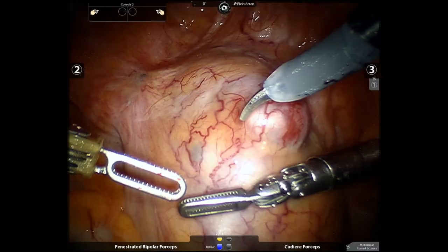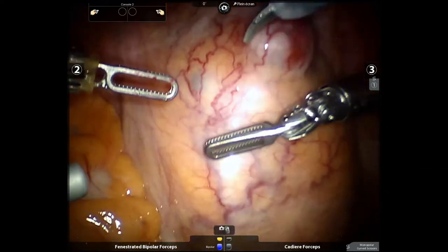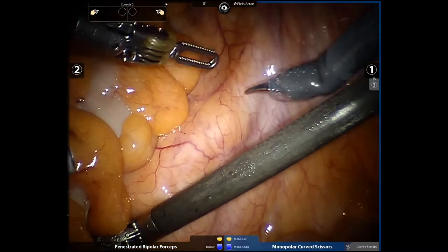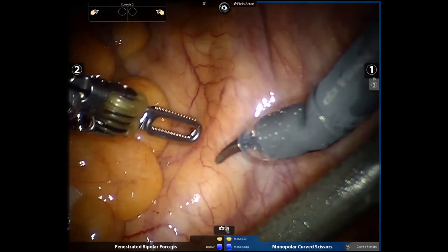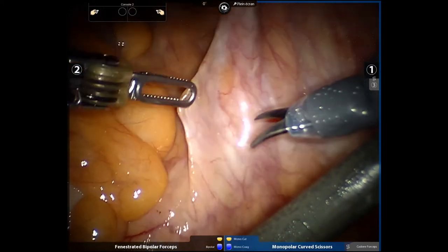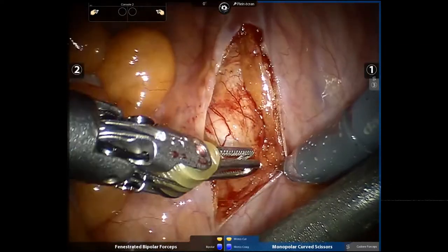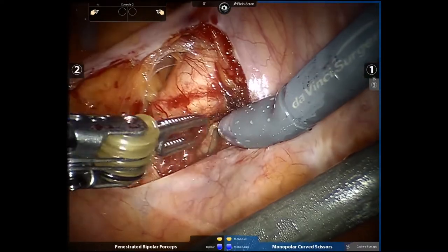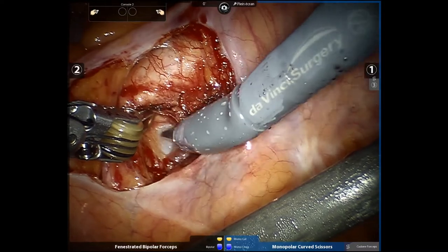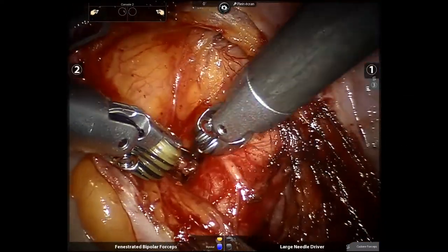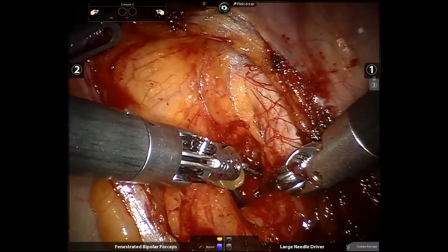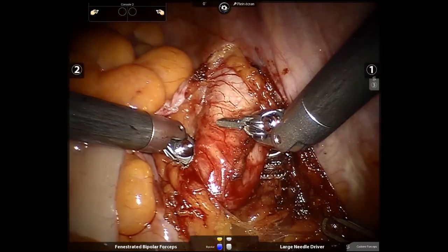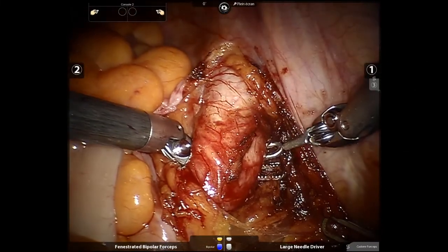The exophytic tumor is seen at the start of the surgery, as well as the graft ureter. The external iliac vessels are then dissected. An elastic is placed in case of an emergency clamping.